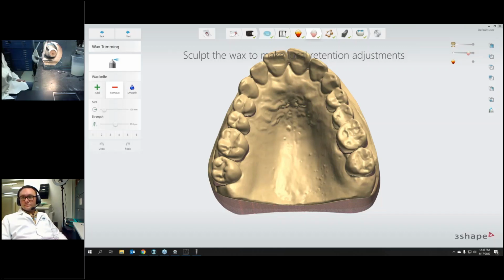So I went ahead and just washed the splints with some cold water. And now what I'm looking for is any sort of deep scratches. I can see that I maybe have a couple on them, but it's not super severe. It's going to be hard to see, but you can see that it's already starting to become even more transparent just from the pumicing. And I did dry them off. So I'm actually going to move to the actual rag wheel with the polishing compound itself, and then we'll go ahead and see how they look from there.